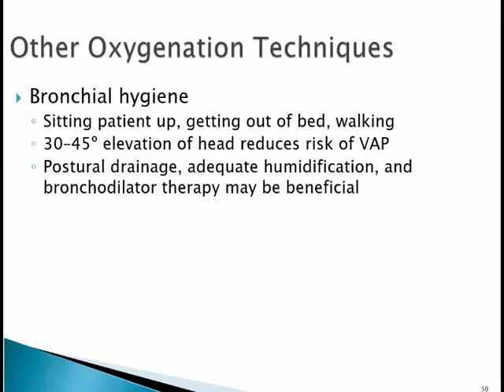Other oxygenation techniques: sitting the patient up or getting them out of bed and walking is better. We're seeing that more and more often these days, where we're actually walking the patient on the ventilator. Of course, it's very labor intensive and personnel intensive because we have to have a lot of people there, but it's certainly good for the patient.